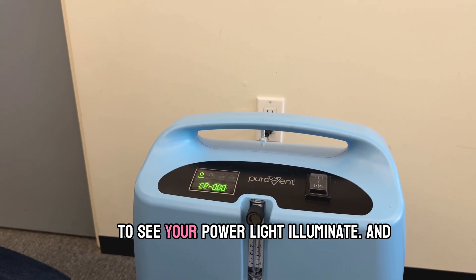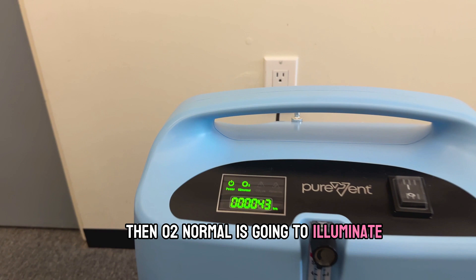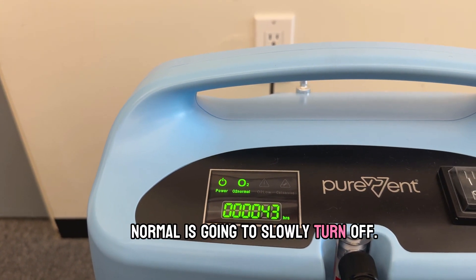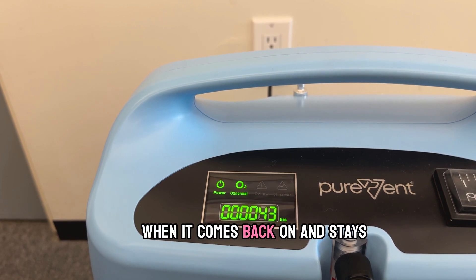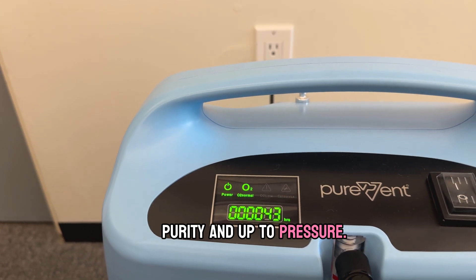Following startup you're going to see your power light illuminate and then O2 normal is going to illuminate. Now until it's fully warmed up, that O2 normal light is going to slowly turn off. When it comes back on and stays illuminated, the concentrator is up to purity and up to pressure.